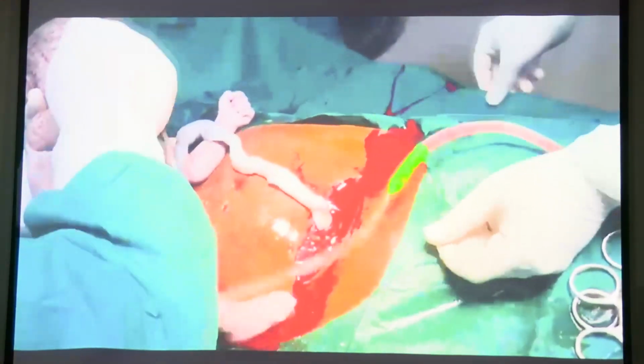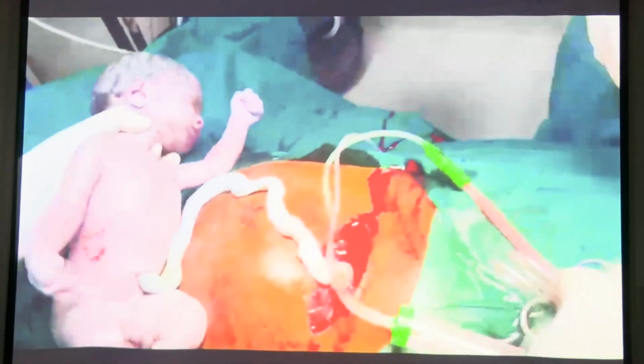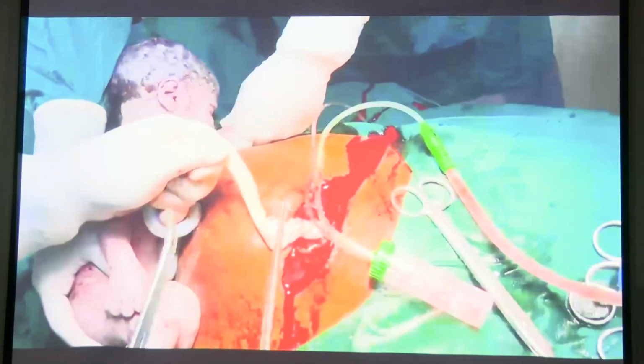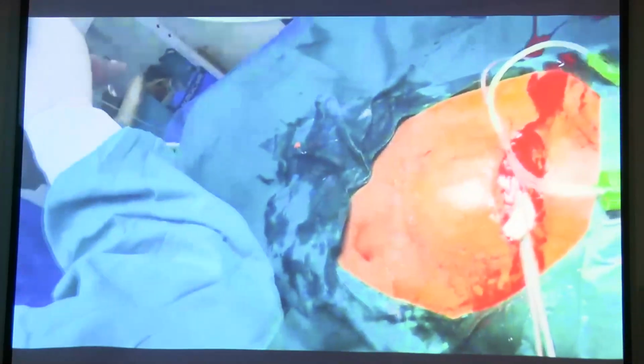Offset. Breech পড়ানোর সময় বলবো। We will talk about that. একটু হালকা সাকশন করে নিলাম। Secretions. Clamping and cutting the umbilical cord. We are going to hand over the baby. After showing it to the mother, we are going to hand it over to the pediatrician.